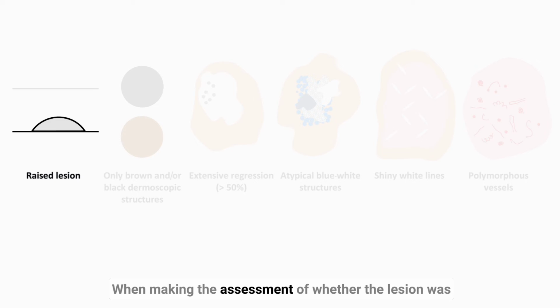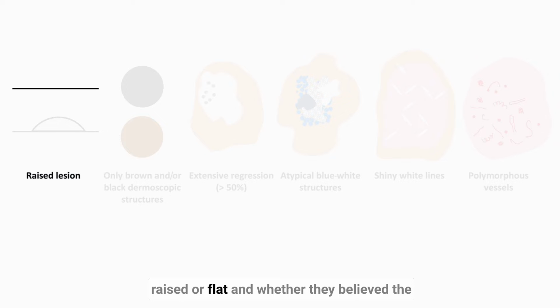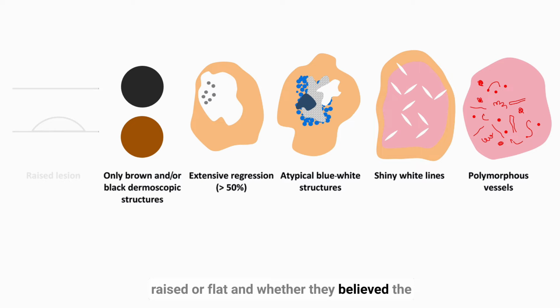When making the assessment of whether the lesion was invasive or in situ, all dermatologists were also required to answer a number of questions. Firstly, whether they believed the lesion to be raised or flat, and whether they believed the following listed dermoscopic features were present or absent.